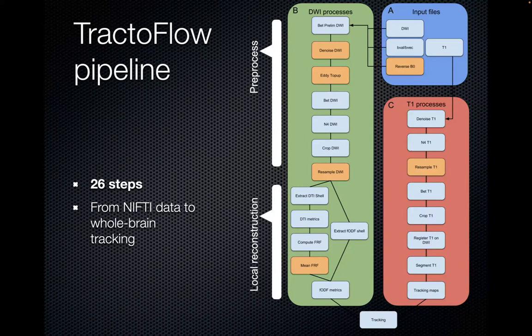So yeah, as soon as we acquire a new data set, like a mouse or a macaque, we have to redo everything. All these steps, keep in mind, are tuned, and the defaults are for a 30-year-old healthy student brain or Human Connectome brain.